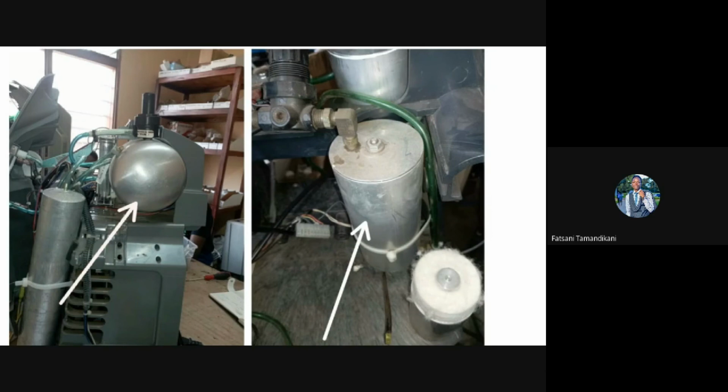And this pressure for most oxygen concentrators is 20 psi. This pressure can be checked on the T connector from the sieve beds to the product tank using a pressure gauge or any other pressure measuring tool.